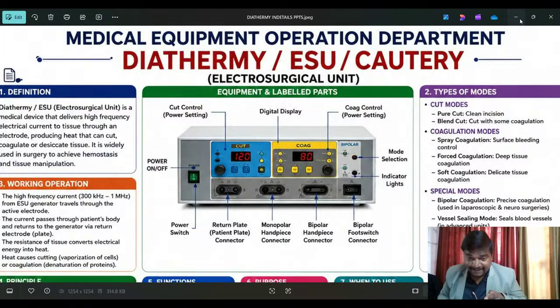Preventive maintenance is next, as per schedule, on a yearly, quarterly or half-yearly basis, depending on your company standards and hospital management. But as a biomedical engineer, to protect the equipment, PMS and calibration are very, very important to save the equipment and to run reliable services.